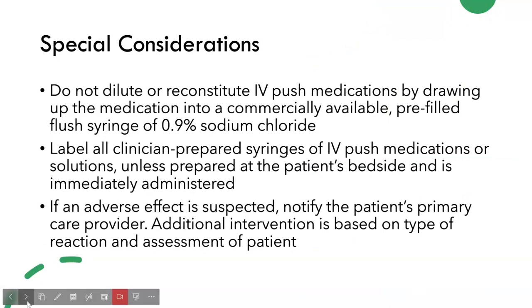Okay, so some special considerations would be to not dilute or reconstitute IV push medications by drawing up the medication into a commercially available pre-filled flush syringe of normal saline. You will see this done, and not all facilities have the little vials of the normal saline or the sterile water, but this is technically not supposed to be done.